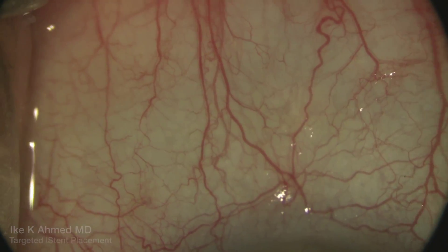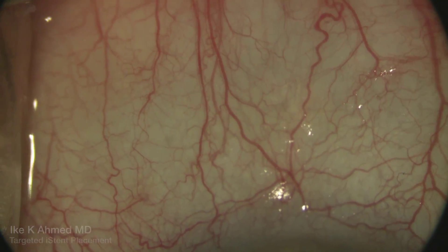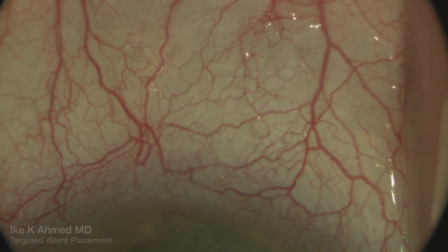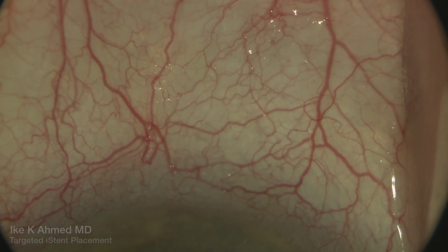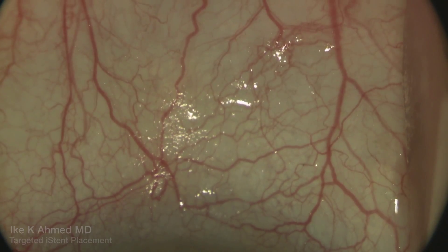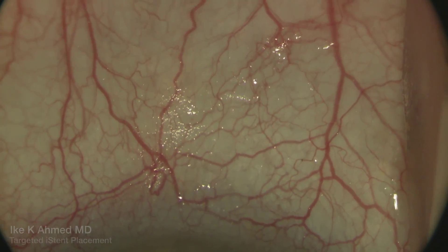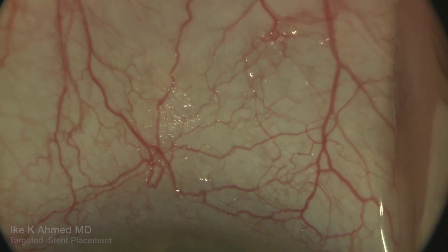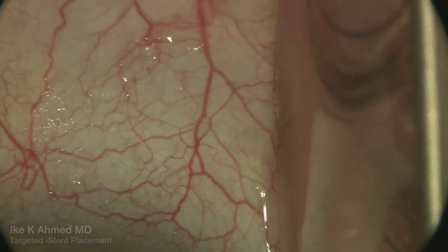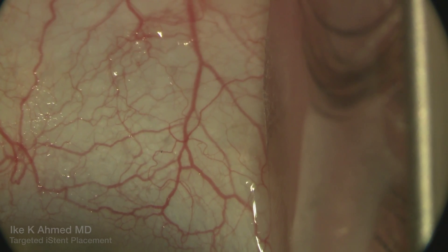Here we're seeing one of the vessels in the infranasal quadrant. Looking in more detail at these vessels in the nasal quadrant, you can see there's a large distribution of these vessels.